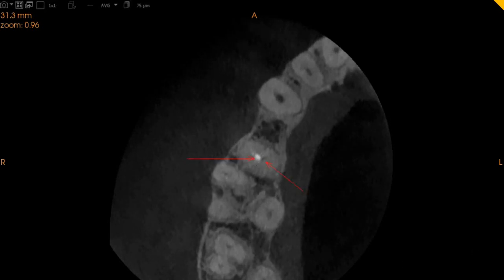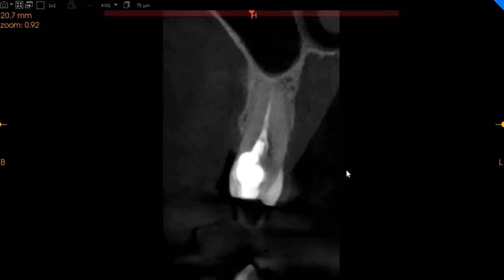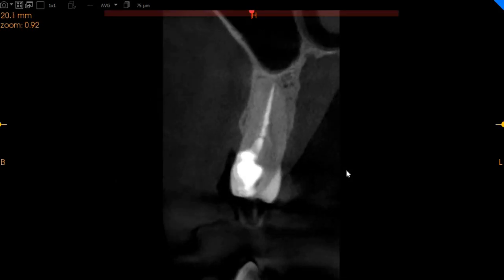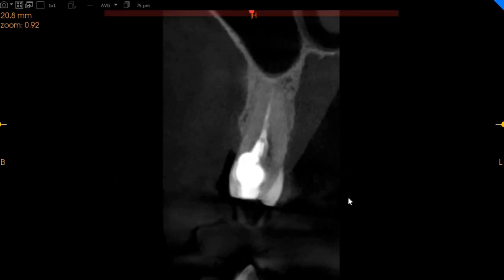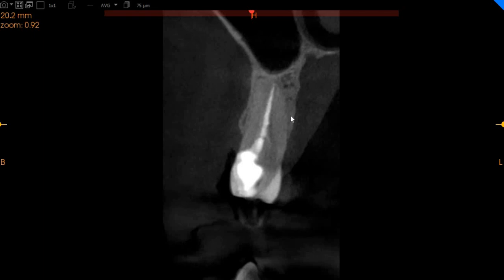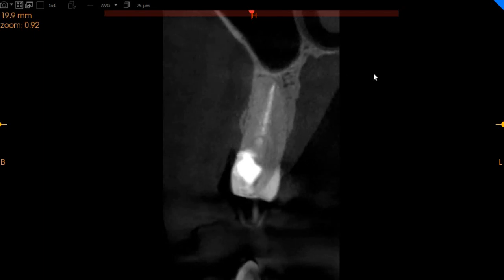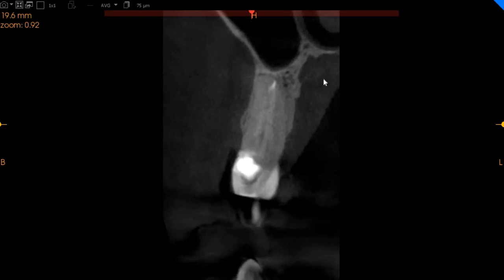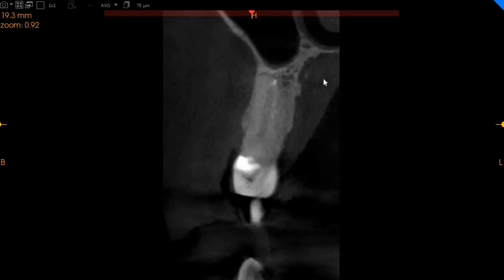This is the trans-axial view, or the proximal view. Here again you can very clearly see the palatal canal, and the buccal which is obturated. But as you move towards the apex, there is only a singular exit, and we don't see any periapical lucency associated or any cracks associated with this tooth.